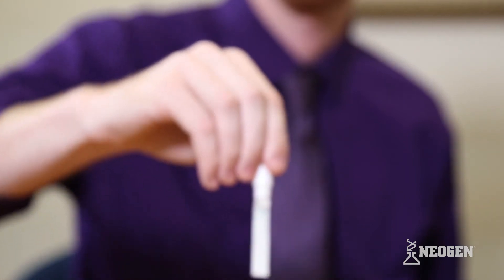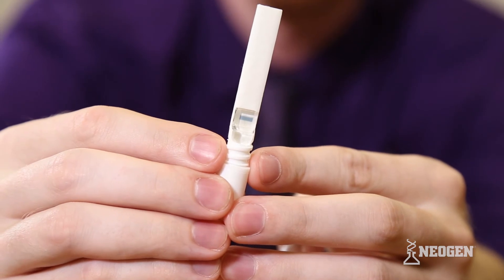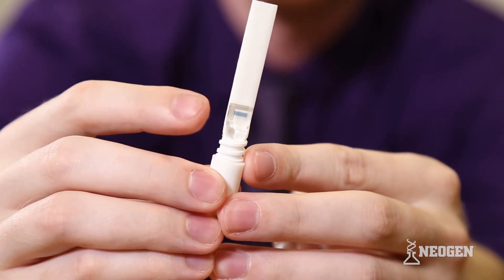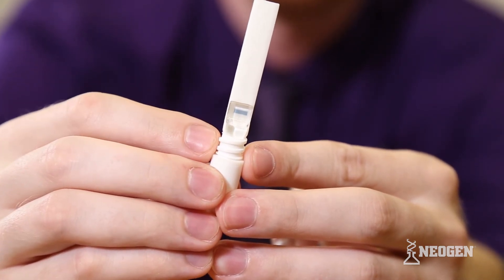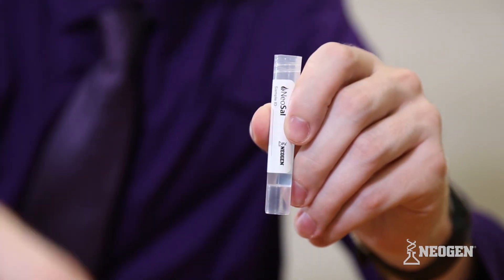The NeoSal's built-in sample volume adequacy indicator, SVAI, will turn blue when a suitable volume of oral fluid has been collected. The typical collection time is one to two minutes.